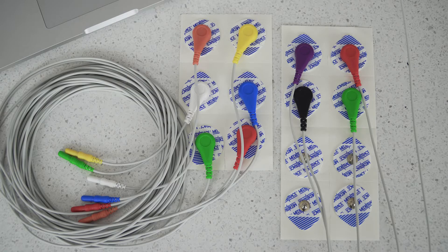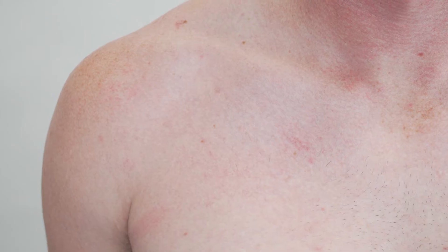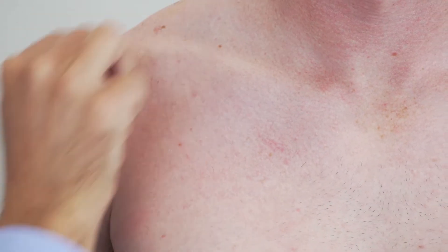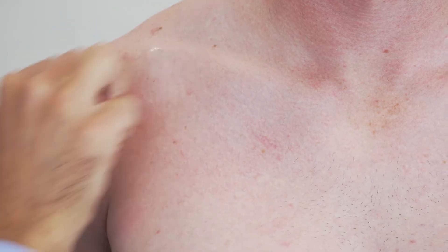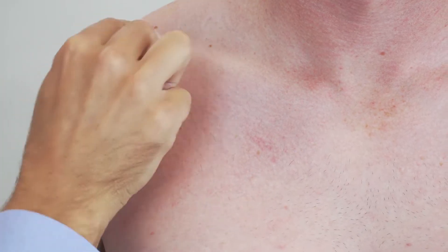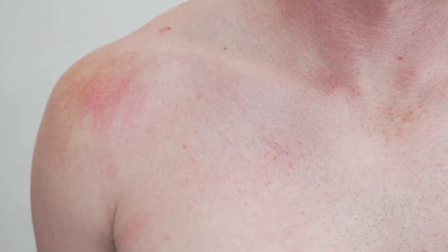Before placing the electrode it's really important that you prep the skin. We use these skin cleansing swabs which are actually just alcohol swabs and we just wipe down the area really well. This is just to remove any oils which can cause drift in your signal.